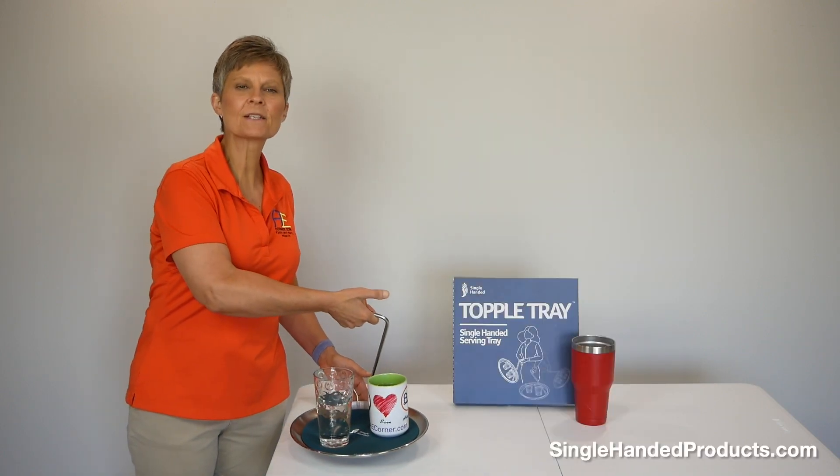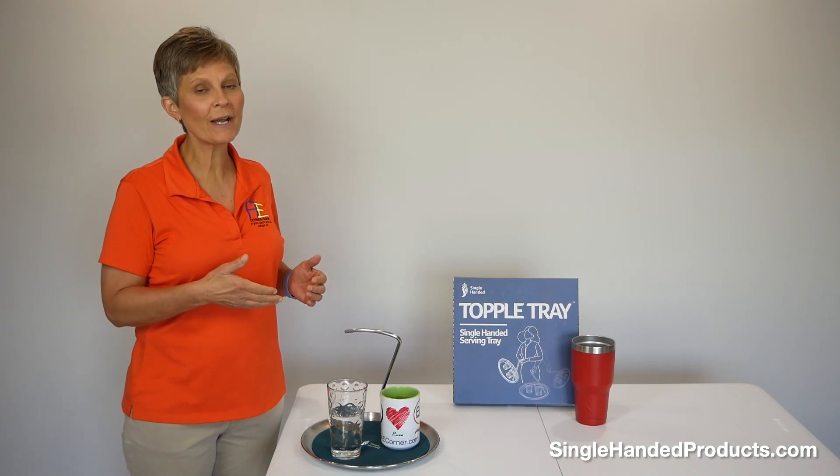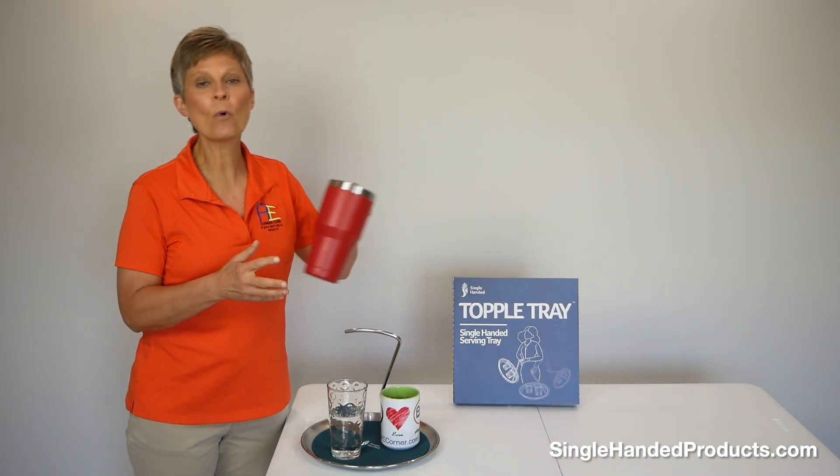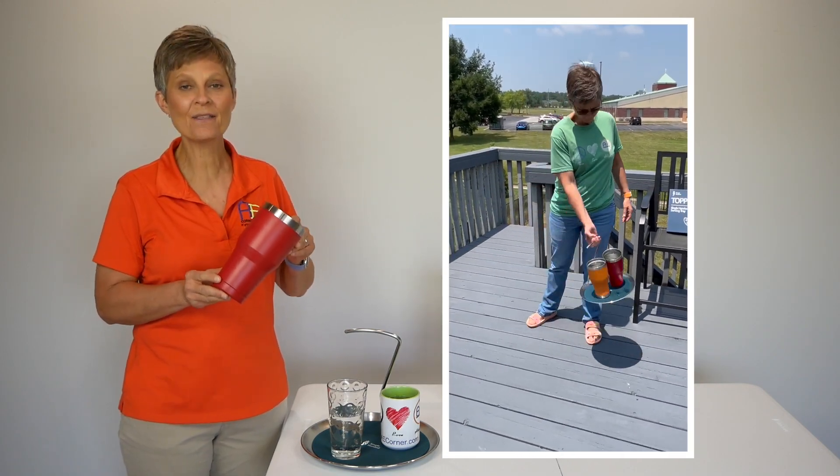This certainly makes things easier to carry. We actually had to push the Topple Tray to the limits with a tall, top-heavy, water-filled tumbler and get a little wild with swinging it around to get anything to fall.